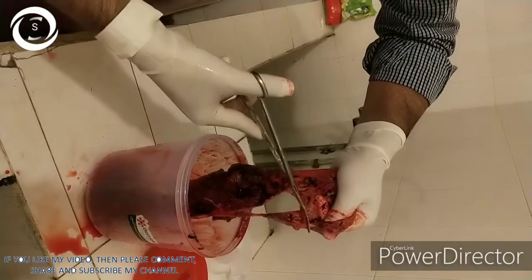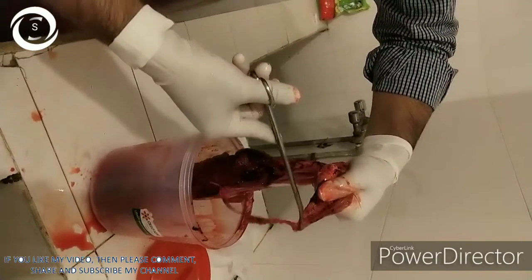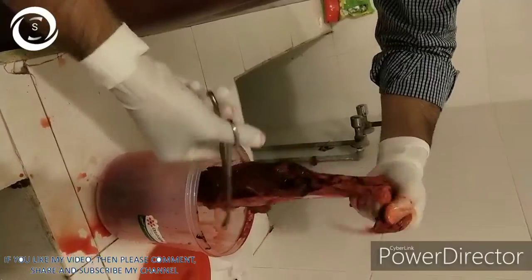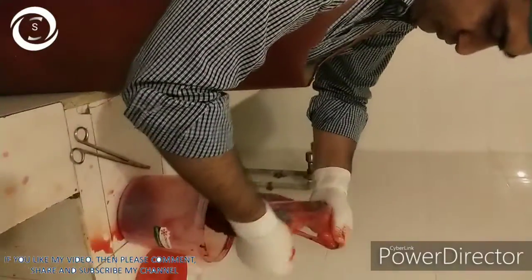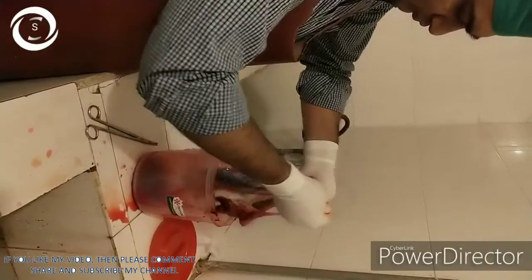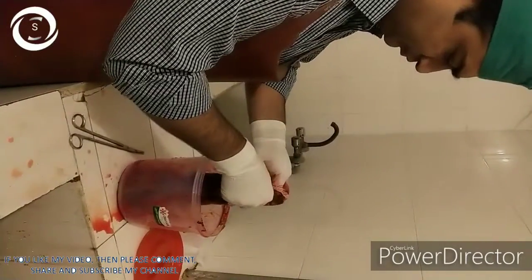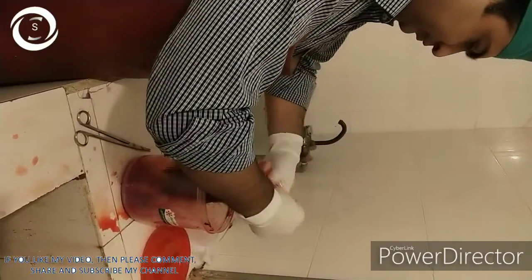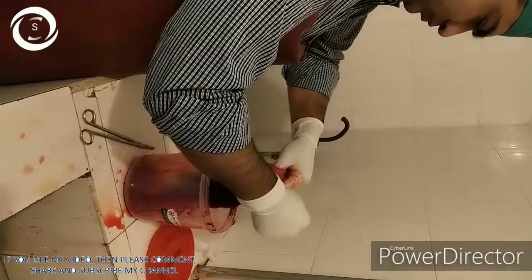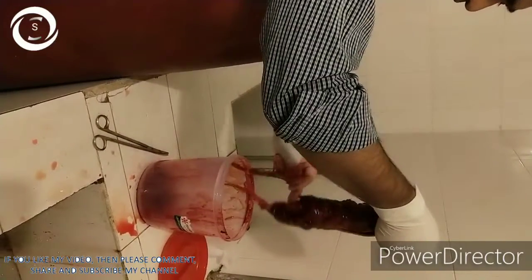You can also take help of the scissors. Your main aim is to remove all the blood from the amniotic membrane and the placental tissue from the amniotic membrane. After complete separation, discard the rest of the chorion and clean it from the blood clots.